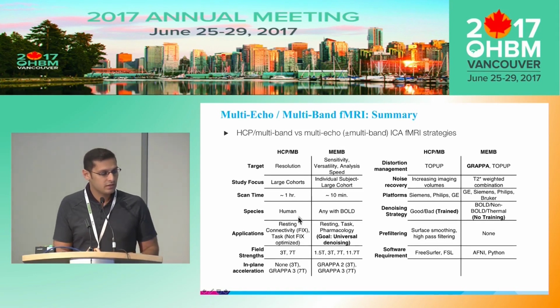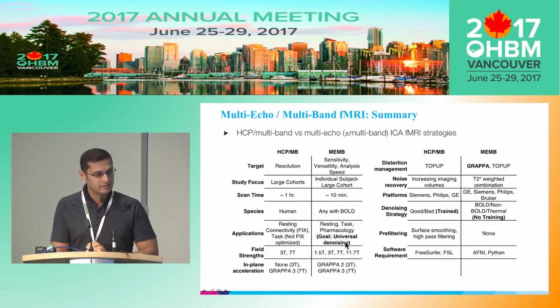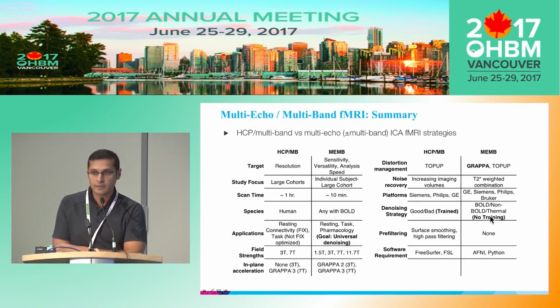In general, the recommended HCP scan time is about an hour. But with the multi-echo, multi-band, we try to get maximum sensitivity within 10 minutes. This is applicable for both task and rest, the multi-echo, multi-band approaches, and it scales across field strengths. And of course, there's no training.